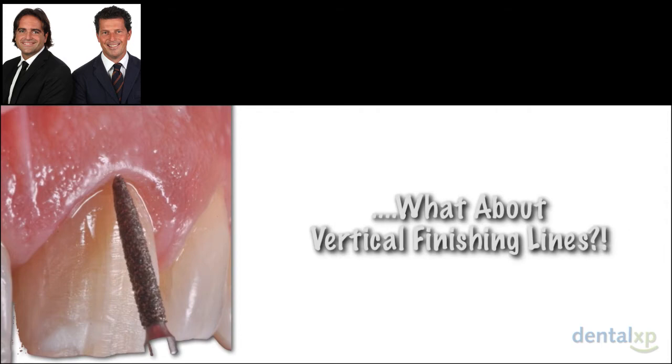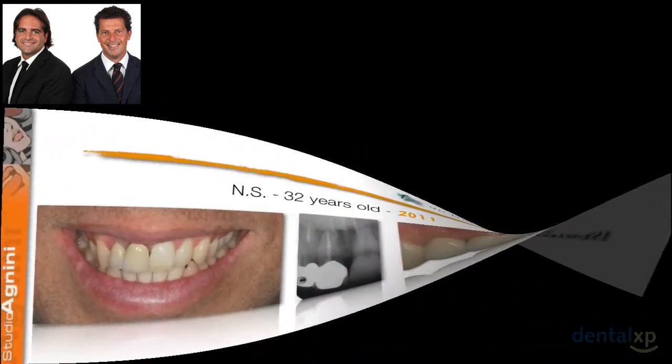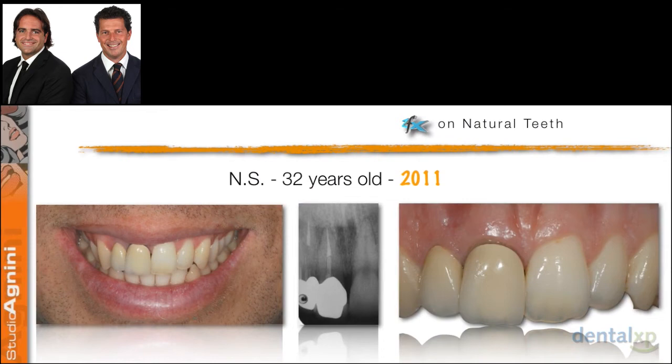Let's talk about vertical finishing lines. How does the system work on natural dentition with vertical finishing lines? Let's see, for example, this case. This is Nicola, 32 years old. He was a patient who entered our office in 2011, also with some aesthetic issues.